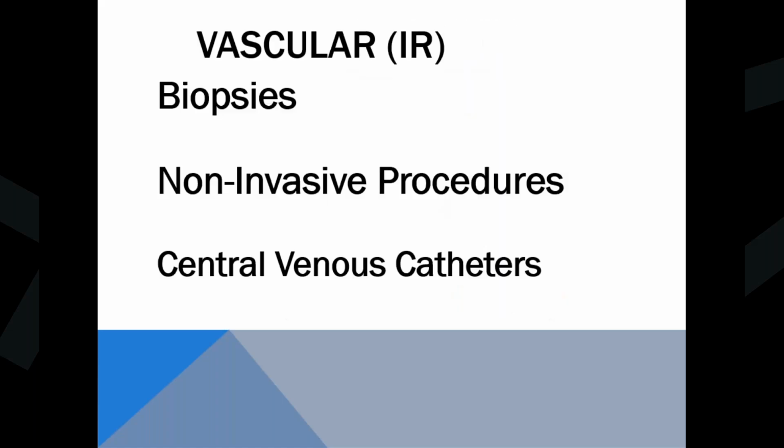A little different setup. Now the machine itself is going to be exactly the same, but interventional radiology basically does the same stuff, but all over the rest of the body. So cath lab focuses just on the heart. IR focuses on anywhere else in the body.